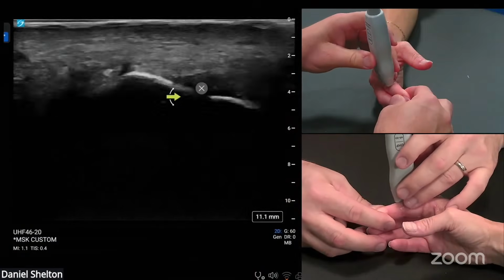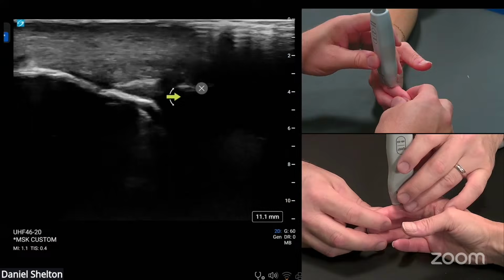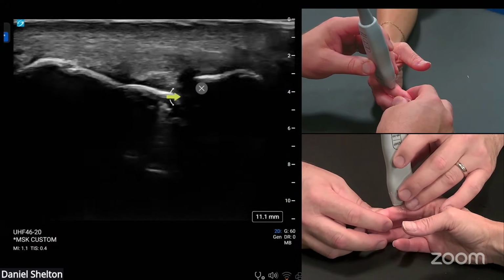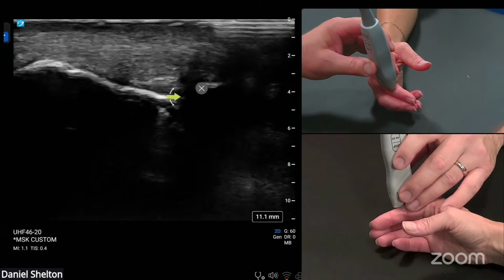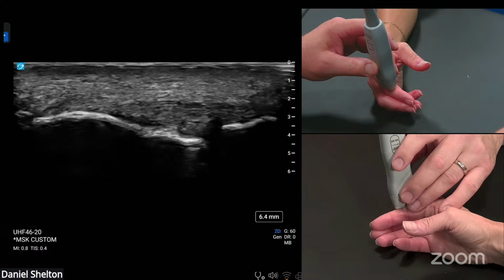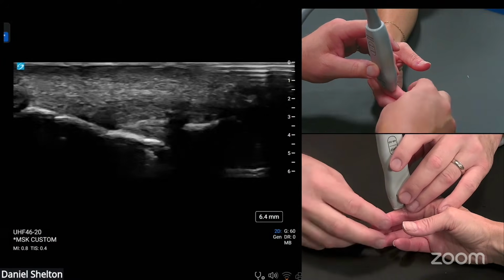Now let's go down to PIP, collateral. Take a look at it. Same scanning technique, looking for that drop off, there we go, really nice. Maybe I just got lucky. Popped it right on there, too shallow. There we go, somewhere in the middle there.